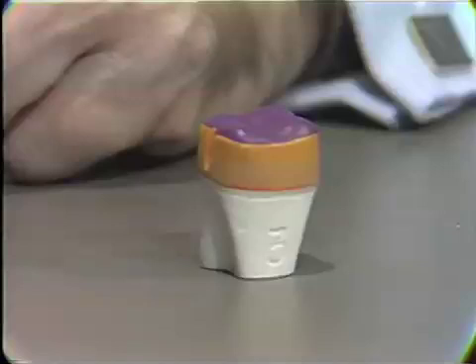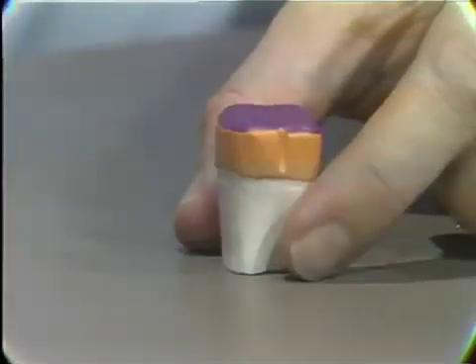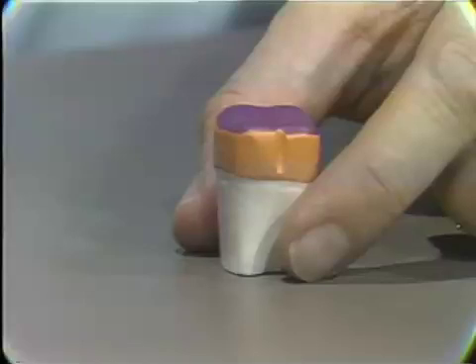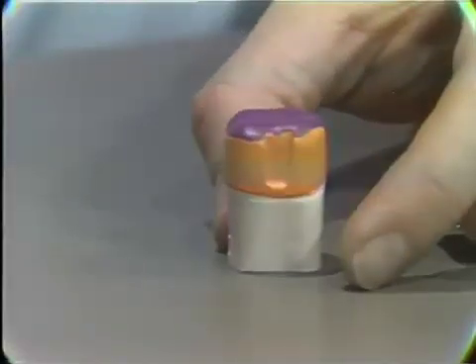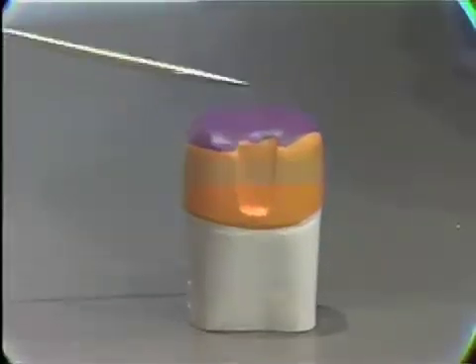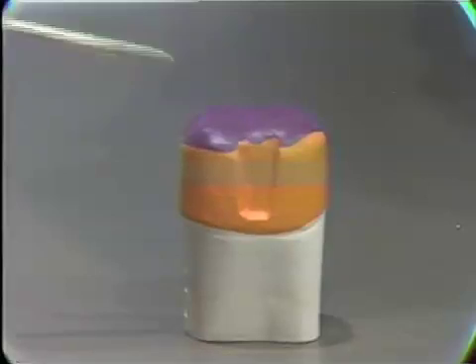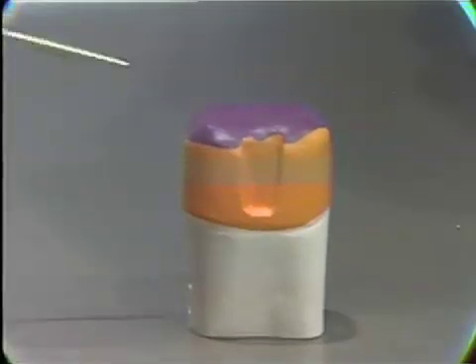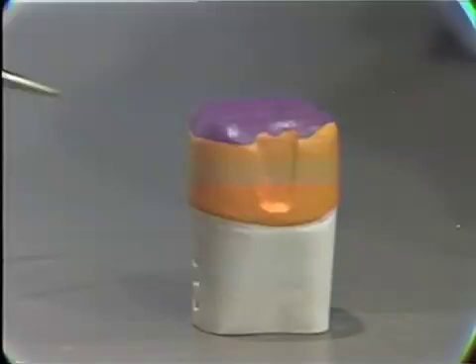And you see such a preparation here on a mandibular molar tooth, of which this is the buccal surface at which you're looking, and the proximal surface and the lingual surface. And here again you've got the maximum retention, all of the axial surfaces contributing towards the retention of this type of preparation.